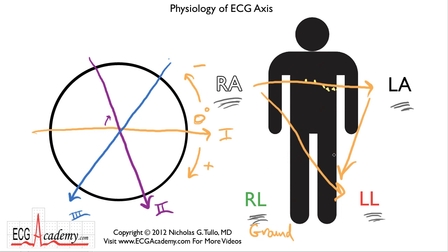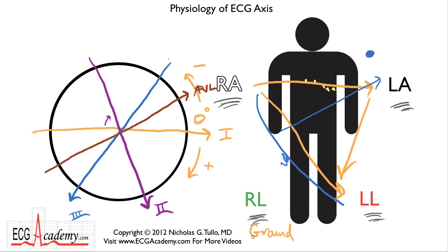Well, the machine also has 3 augmented limb leads, AVR, AVL, and AVF. And basically what happens in AVL, the left arm is taken as one part of the recording system, and the other pole comes from the other leads, basically summed together. So it's almost a unipolar signal, but it's basically looking at signals running towards the left arm. And by convention, we consider AVL to be 30 degrees above the horizontal in this direction.